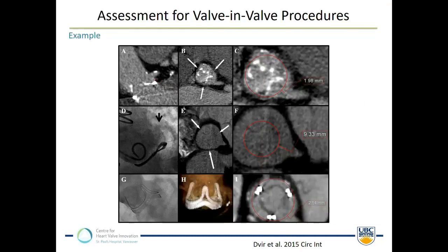And if that surgical valve is canted towards the coronary, or if the sinuses are not capacious enough, the risk of mechanical obstruction is elevated. And some people said, well, why don't you just measure the sinus of Valsalva? The issue with that is that the sinus of Valsalva is only a modest predictor of risk because it ignores the surgical tilting. So if the valve is tilted towards a coronary ostia, despite a capacious sinus, that covered stent may very well tamponade the left main coronary artery.